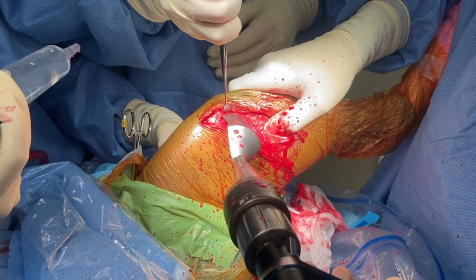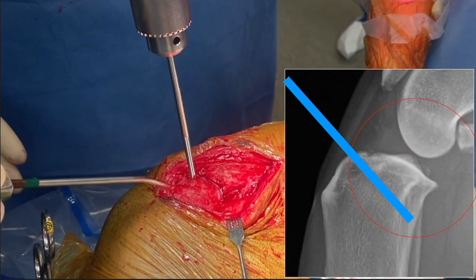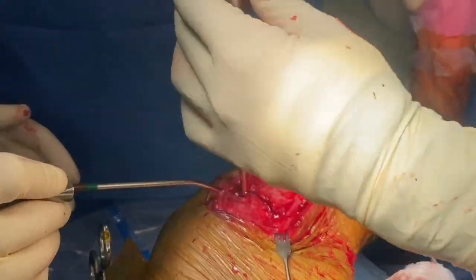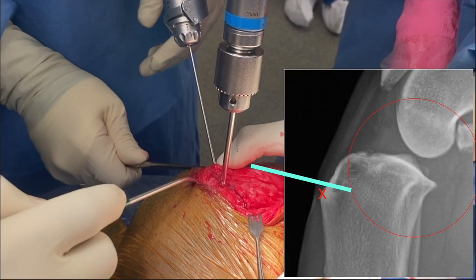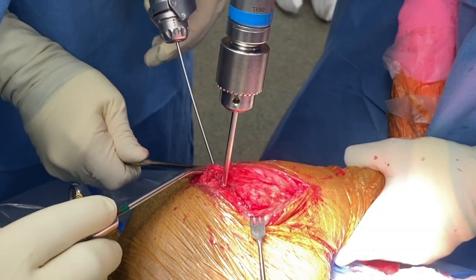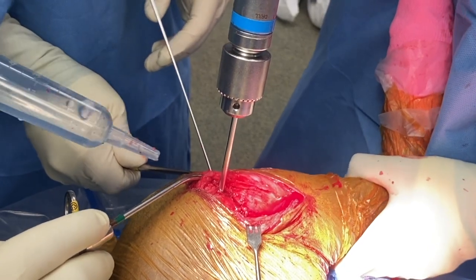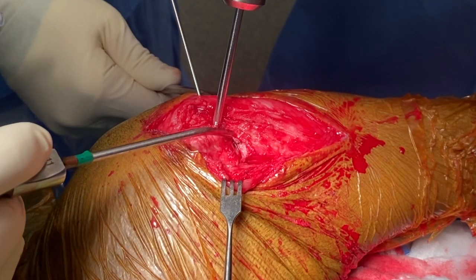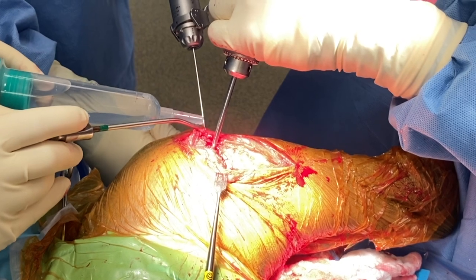Completion of the osteotomy should be obvious if pressure is applied across the osteotomy with the supporting hand. A threaded pin for rotation is placed cranioproximately angled cordolaterally. Then I like to pre-place the anti-rotation pin in the tuberosity, which must be above the patellar tendon insertion. The plateau is rotated while maintaining proper tibial alignment until the score marks in the proximal and distal segments are opposing. The anti-rotation pin is driven through the caudal cortex of the plateau segment.